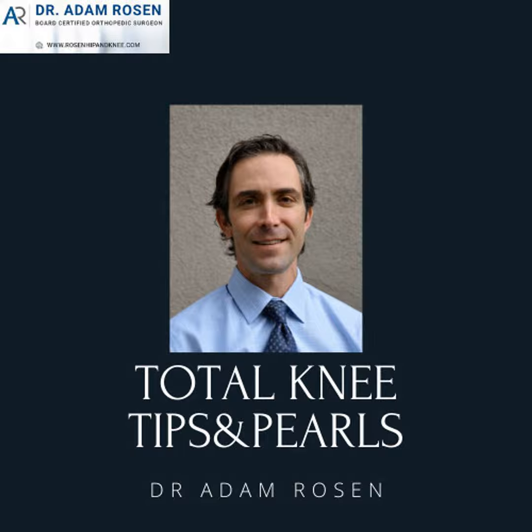The other thing which I find works really nice is a large bone tenaculum. If you've done your medial release, you can put the tenaculum around the tibia, going around the medial side to the posterior side, and then use the bone tenaculum in the front at the patellar tendon insertion, just above the tubercle, and clamp it down. It just protects your patellar tendon from potentially being avulsed off during the procedure.